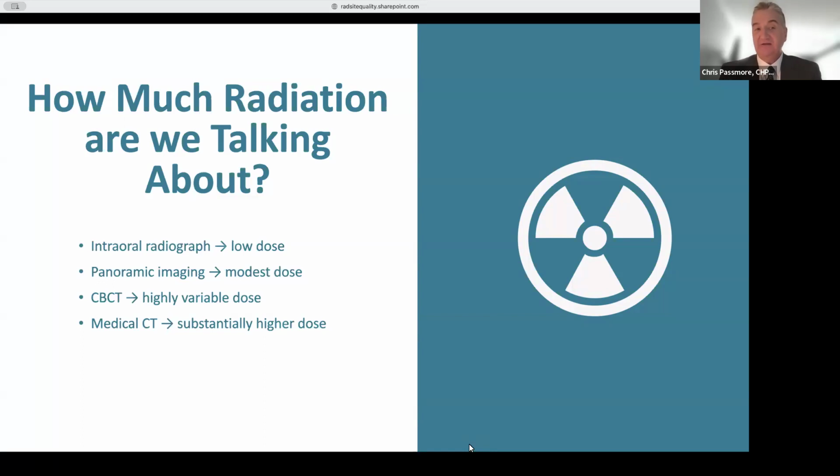With the CT, we're seeing a higher dose, and that's because at about 1 meter there's a little more scatter, and it's about 0.4 millirem per scan that we see per year. So depending on where the person stands, it could go all the way up to 4 millirem per year or per scan. So it's really important to know where to stand when interacting with the equipment.